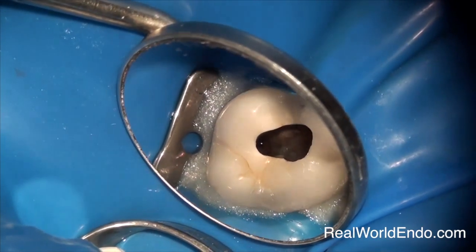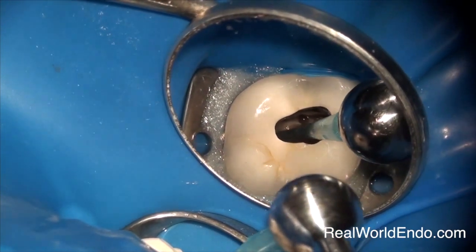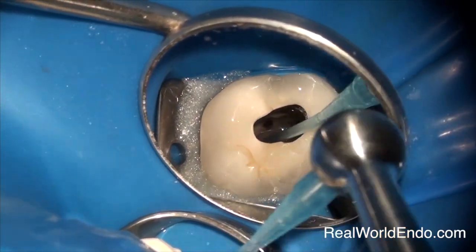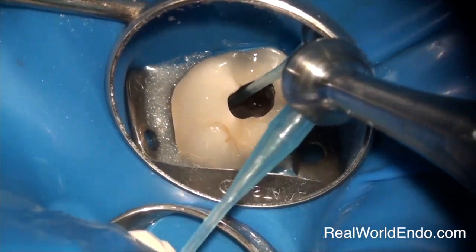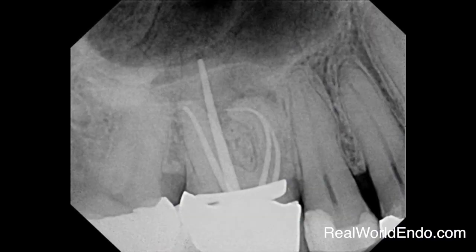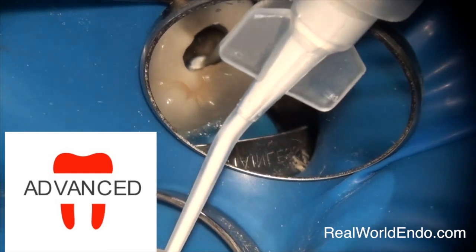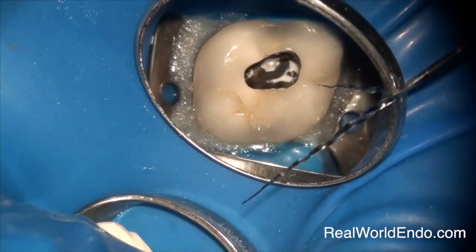Access has been made through the crown and instrumentation has been done. I elected to use the advanced Endosequence technique here. I'm doing a little bit of final irrigation using full-strength 6% hypochlorite, then using a macro cannula with slight negative pressure to remove the hypochlorite. Then I'm doing a cone fit to demonstrate the fit of the master cones. You've got four canals here and the preparation has been done to a large enough size.